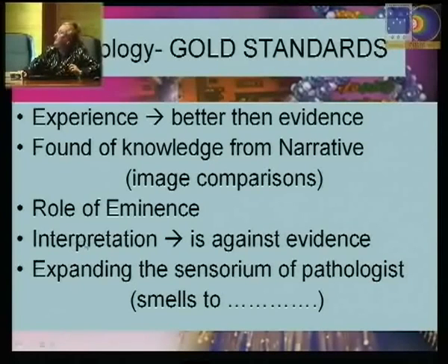This is based on interpretation, which obviously has nothing to do with evidence. You just interpret things in the way you think they should be interpreted according to your experience and the images you have seen previously. And you have a sixth sense, or sexto sentido in castellano, that when you see something, this smells to me like a neoplasia. And probably your first impression is the right one.